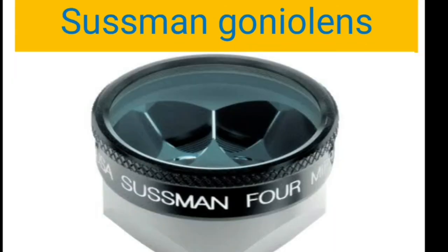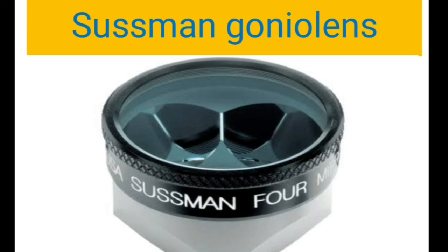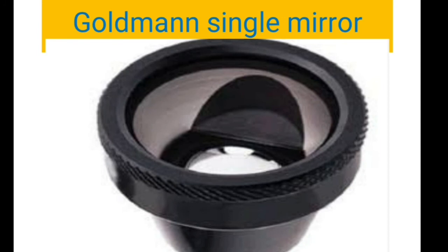The SUSSMAN's goniolens also has 4 mirrors, but it doesn't come with an Unger fork handle or an inbuilt handle. The advantage of the ZEISS 4 mirror, POSNER's and the SUSSMAN goniolens is that at once you will be able to visualize all the angle structures. You need not move the goniolenses. So what are the differences between all these lenses?